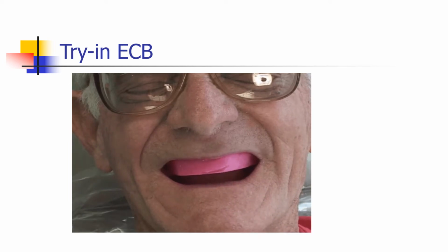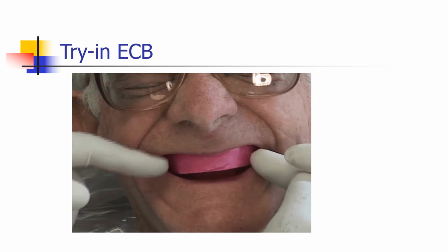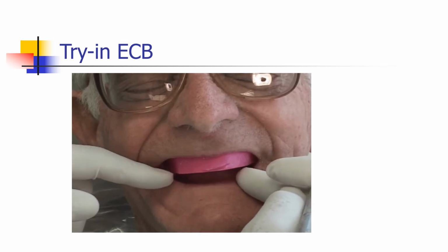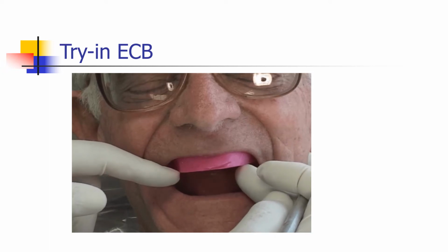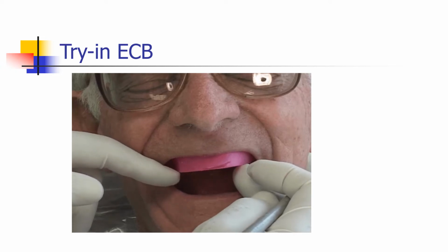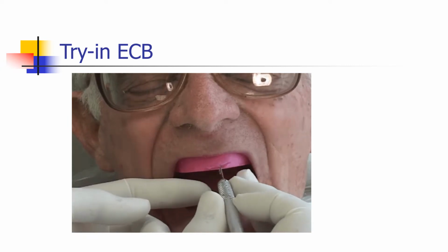This is a very balanced smile that we got, and we didn't have to do anything except use the rim former, and we come to the mouth and it's right on the money. Many times it's not, and so you have to adjust it so that when they smile wide, there are equal amounts of plastic showing right and left, so that you get a smile that is balanced. That's all we care about in aesthetics, this wide smile to have the teeth balanced within that smile. And then what we're going to do now is mark the midline.